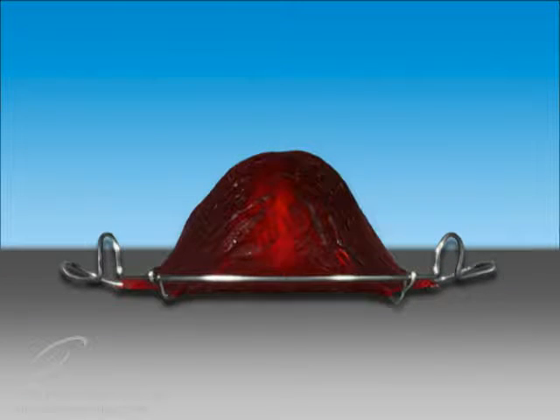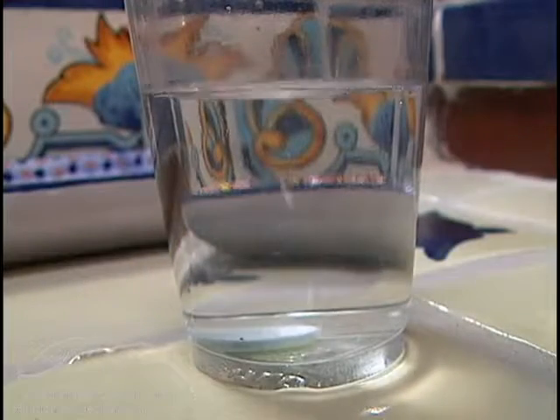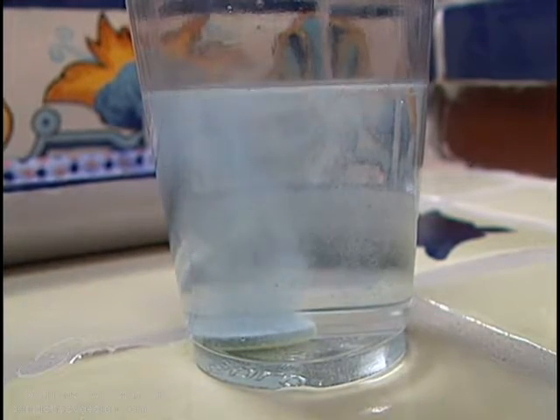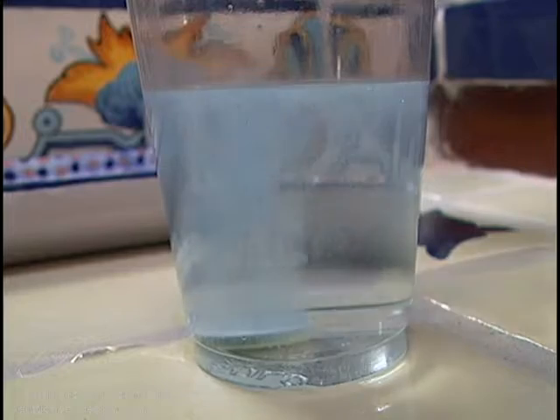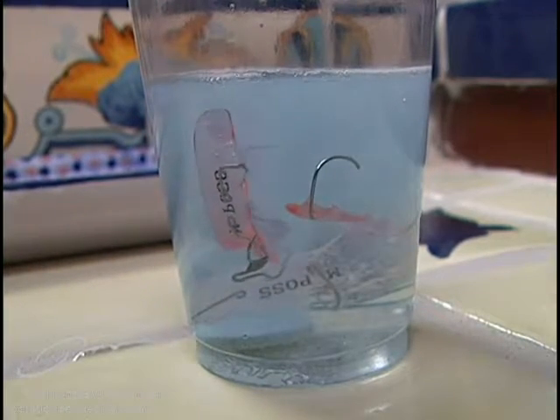If plaque builds up on the retainer over time, it will dry and harden like tartar and will be difficult to remove with a brush. Denture cleaners or a combination of vinegar and water are effective in removing this tartar. When using a denture cleaner, follow the directions on the package. Do not leave the retainer in the cleaner for longer than 10 minutes. Use once a week if needed.